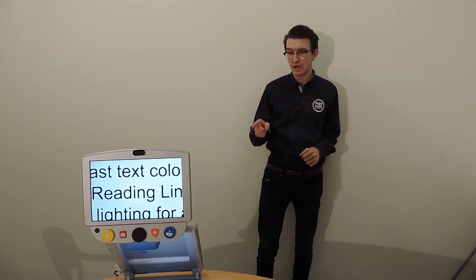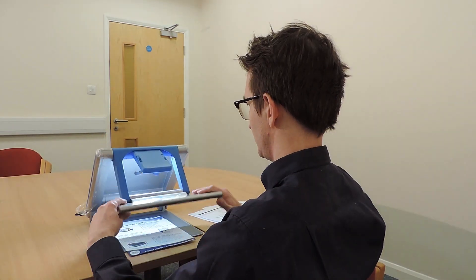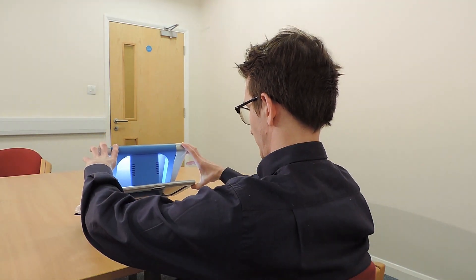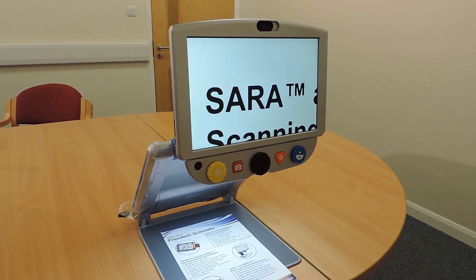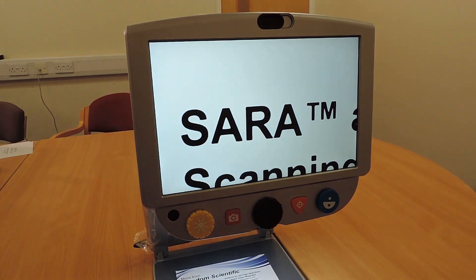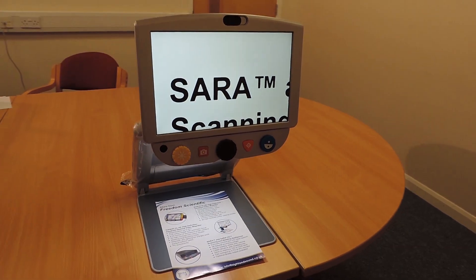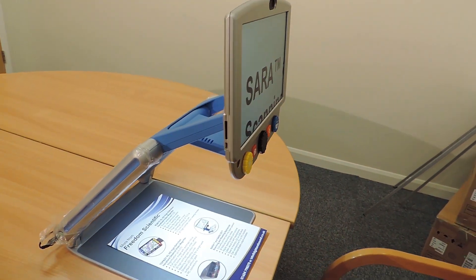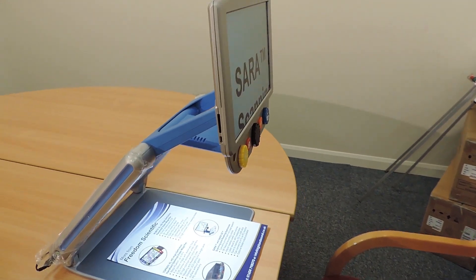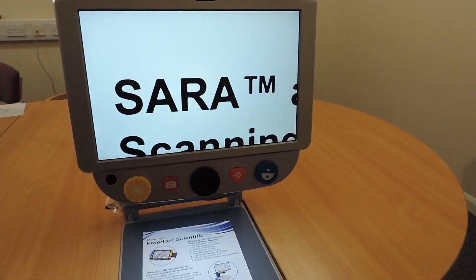Now let's take a closer look at the Topaz PHD. The Topaz PHD is a lightweight portable video magnifier — its collapsible design makes it easy to move around. The Topaz PHD includes a high definition camera with an auto focus lens that displays high quality images. It is available in a 12-inch model and a 15-inch model, and can also be purchased with a battery so you don't need it plugged into a wall socket. The magnification range goes up to 24 times for the 12-inch model and up to 31 times for the 15-inch model.